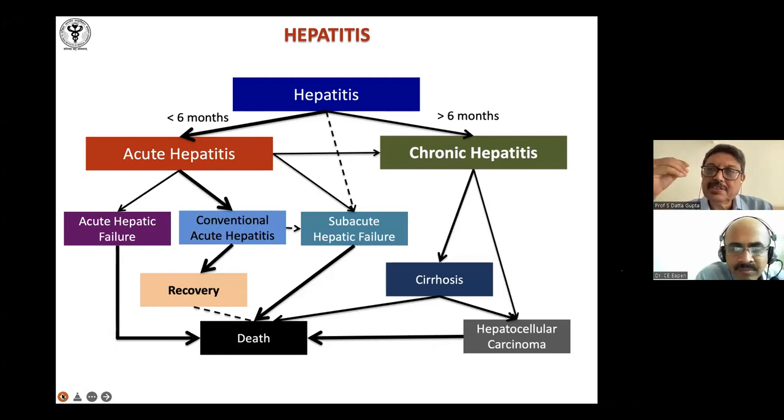So when the hepatocytes undergo necrosis and they are now regenerative, the lipofuscin that was there in the hepatocyte is taken up by the Kupffer cells. And from the Kupffer cells and macrophages, it goes into the portal tract. So if you find this diastase PAS-positive material in the Kupffer cells and in the portal tract, there has been a recent episode of hepatocyte necrosis, which you may not see otherwise.